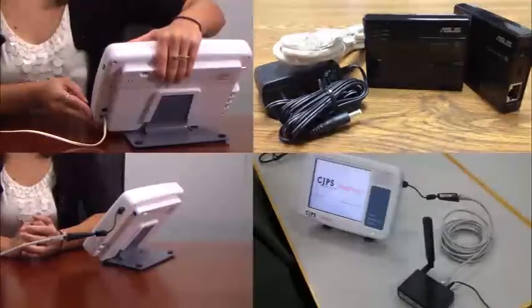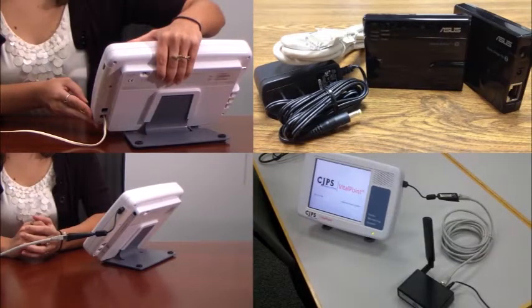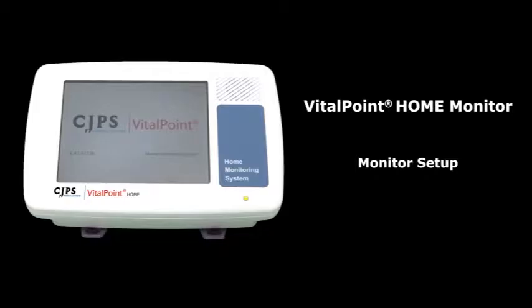A unique feature about the system is the fact that there is never an IP address or phone number that needs to be entered into the monitor, regardless of where it is used. It automatically knows where and how to connect, whether it is using a phone line, the wired or wireless Ethernet, or through the cellular network.